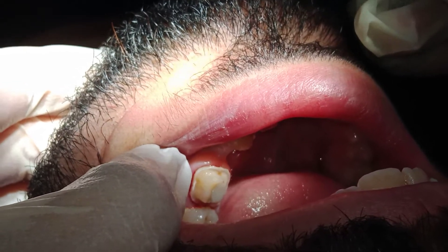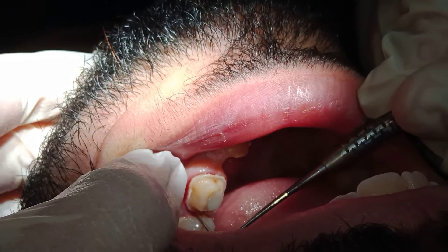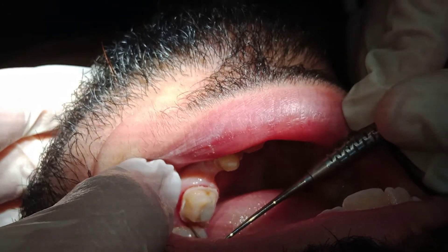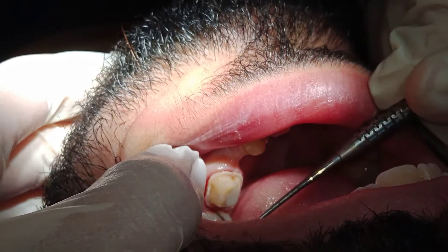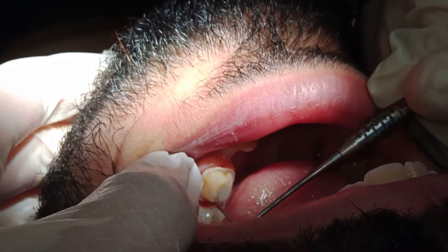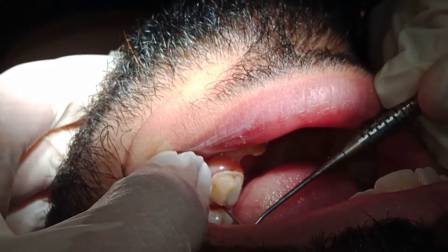What I have now — once more with the probe — when she drags the probe going from one end to the other, she could not. There is still contact area. So even if you see that the papilla buccally is high and the papilla lingually is high, but still in the middle I don't have clearance of the contact area of the teeth.